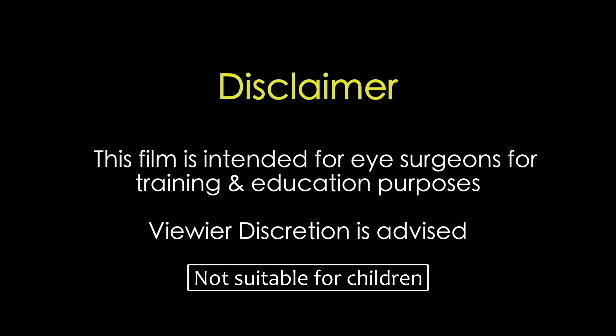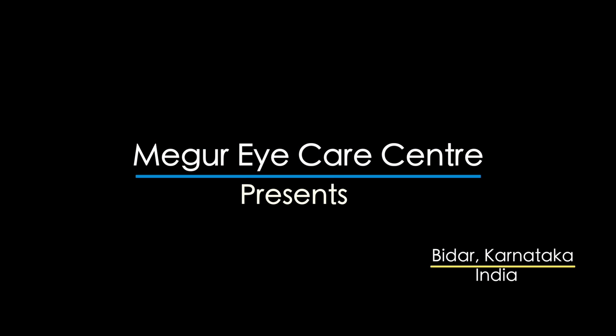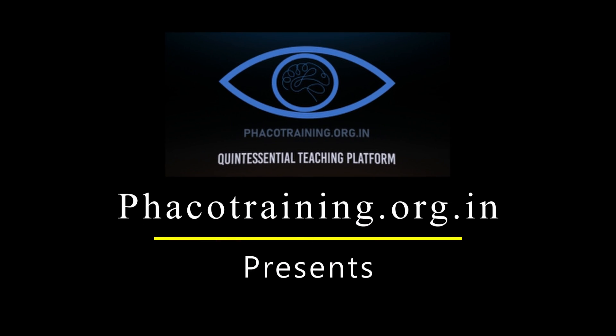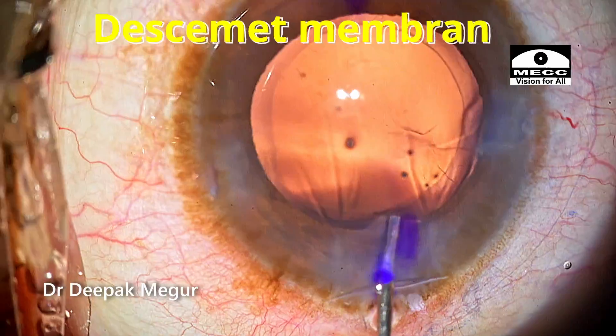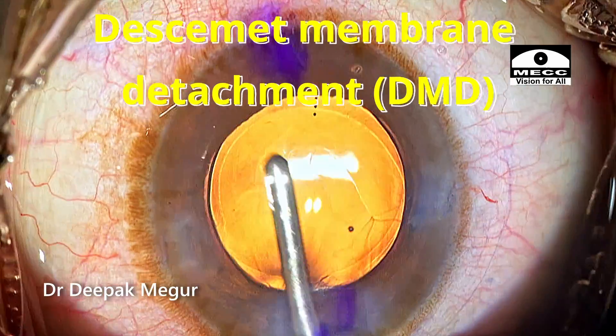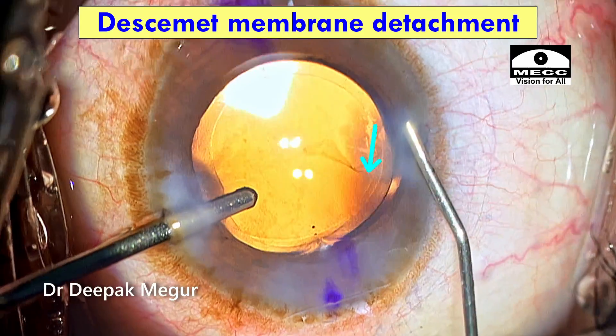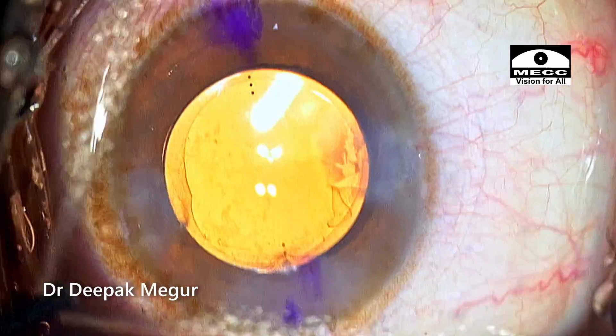This film is intended for eye surgeons for training and education purposes. Viewer discretion is strongly recommended. Hi, this video is about a small Descemet's membrane detachment which was encountered at the region of the side port, and let's see how we could manage this case.